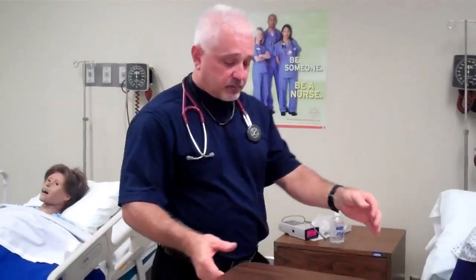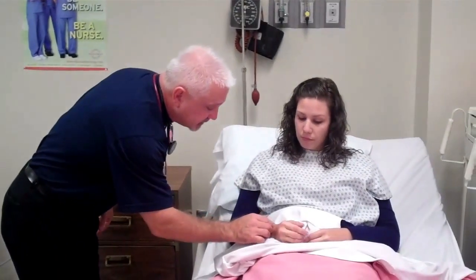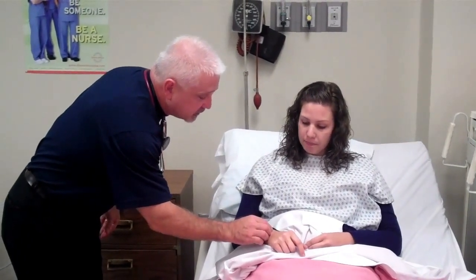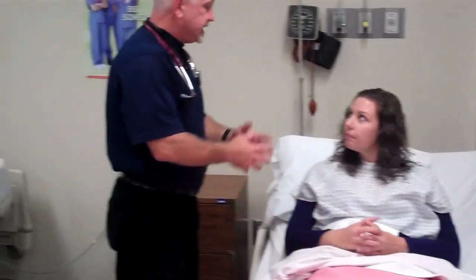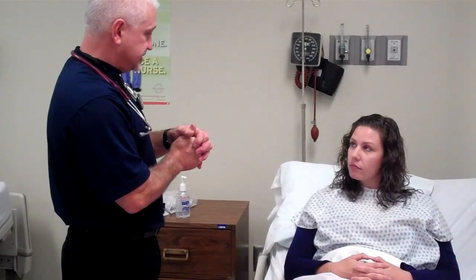Now, I would move this table out of the way, and I would first check my patient's ID. It's Miss Hatch, and your date of birth? 4/28/89. Okay, great. And Miss Hatch, how do you feel right now? I feel okay right now. Feeling okay right now? Well, the doctor felt that you needed some oxygen. I'm going to listen to you, and I'm going to check your vital signs. Have you been experiencing any kind of shortness of breath? None at all? Okay. Any kind of chest pain or anything?